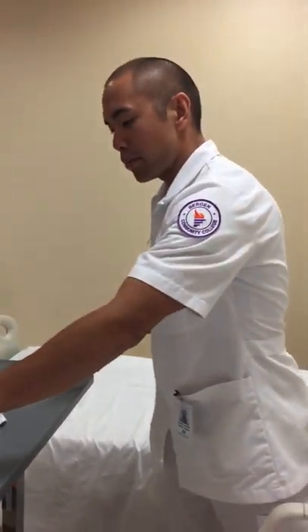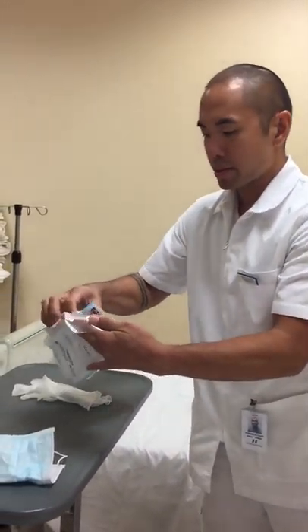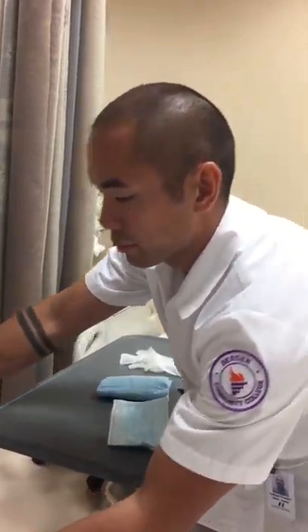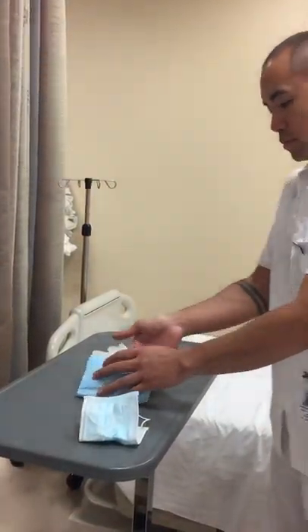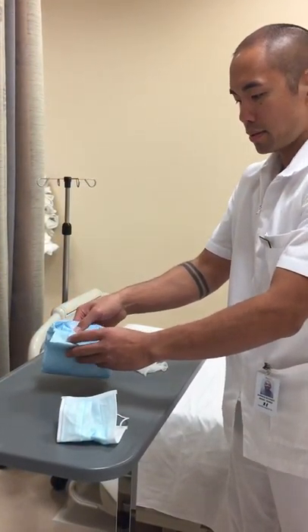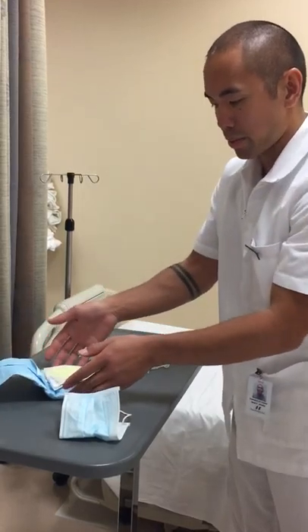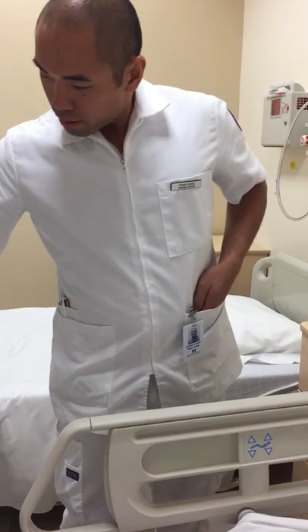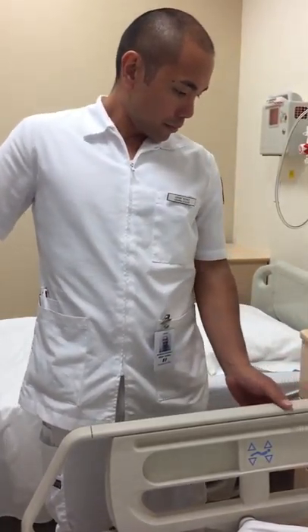I'm going to go ahead and put the mask onto my patient. But first, I'm going to open this so I can have my mask ready as well. You can use this almost as a receptacle for garbage if you don't have a waste can near you. I'm going to open this — you want to be careful not to expose this, as this is my sterile field for later. Here's my mask, here's the patient's mask.